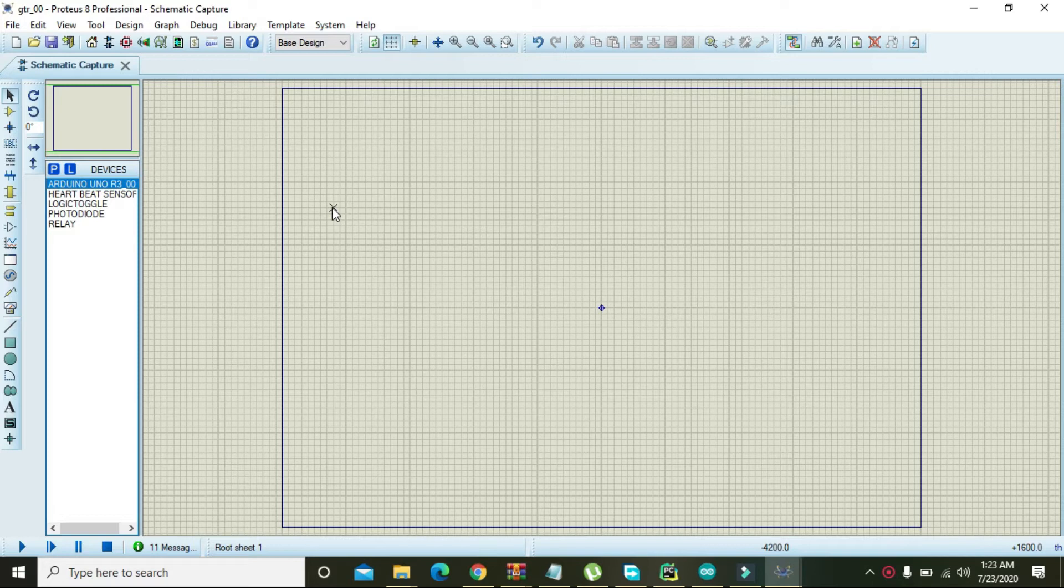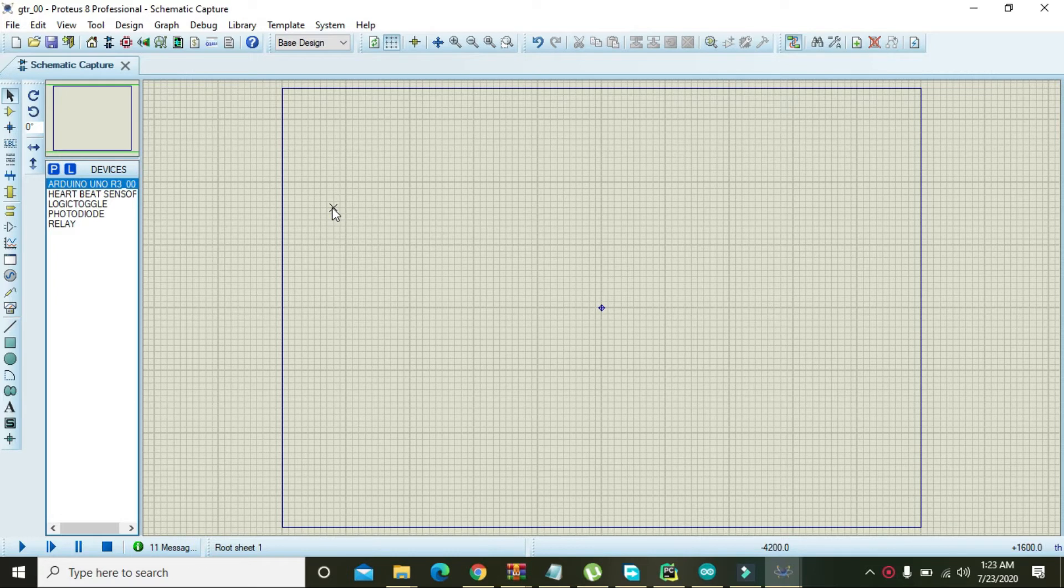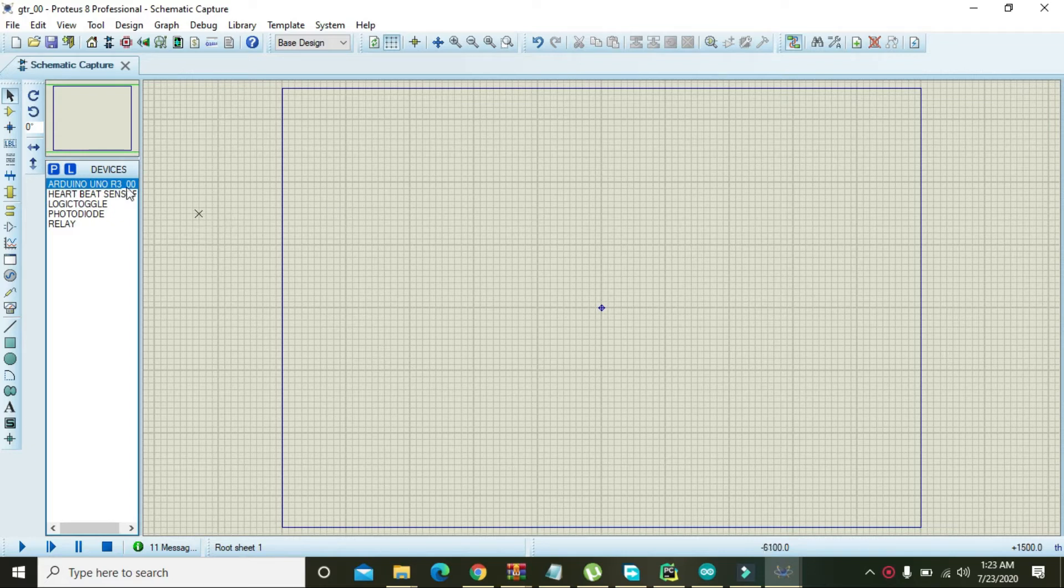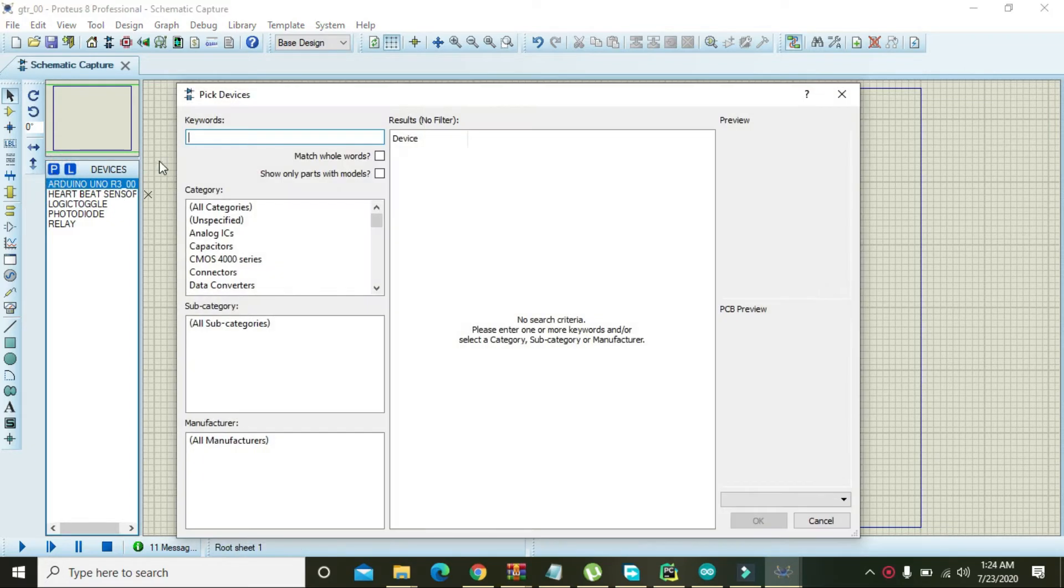So you must have to download this library, or if you want to use it directly you can download the link that I have given inside the description. For it, first of all you need to go to the parts in here.